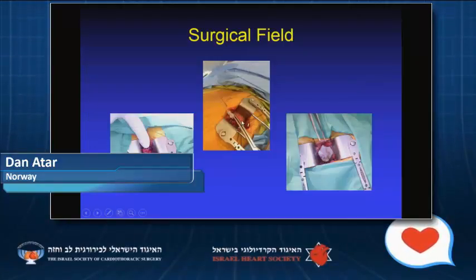From the surgical point of view, we use the transapical approach, typically the fourth intercostal space. This is the head of the patient, the left side, the right side, the leg of the patient here. Initially we get the pivot perfect projection by angio, and then we put a needle above the chest of the patient, and we see in the fluoro the right dimension that we need to puncture from the apex. So we draw a virtual line, which is our direction of the puncture of the apex. And then we puncture the apex and perform the procedure.